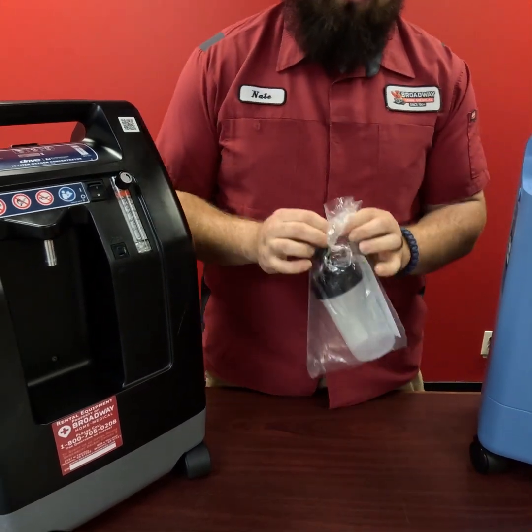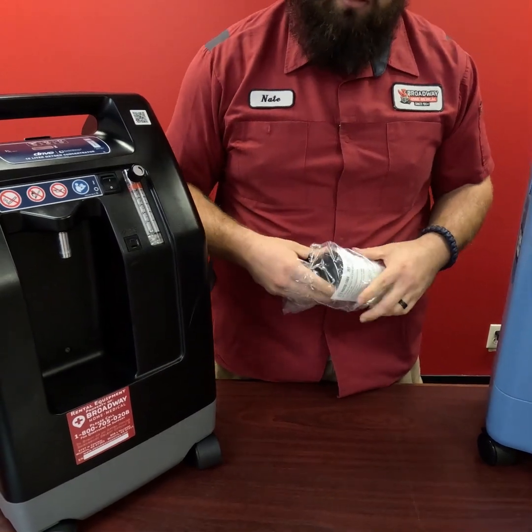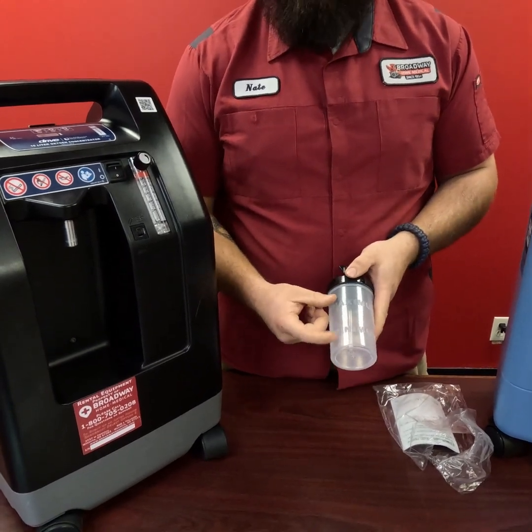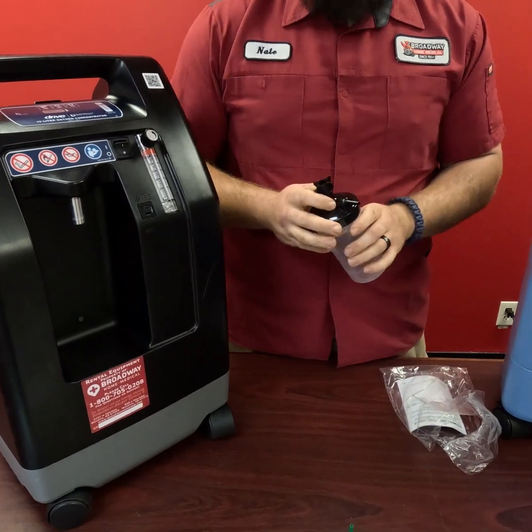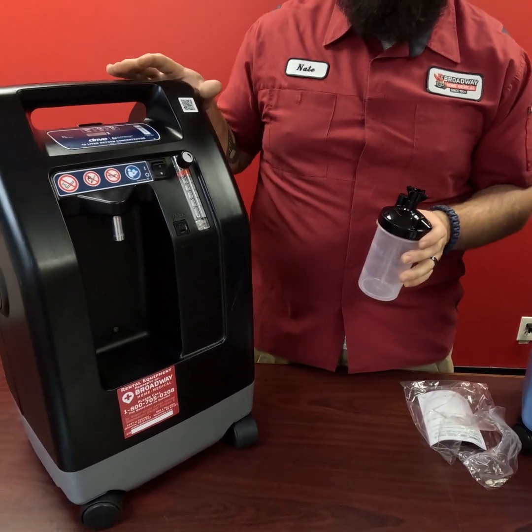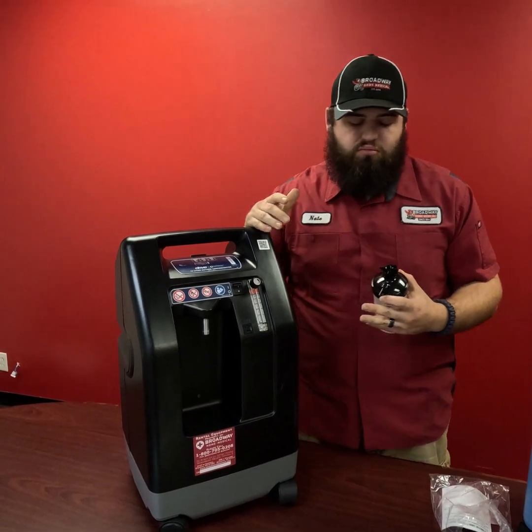Now these humidifier jars should only be used with distilled water only. If you do use any other kind of water, you will get contaminant buildup in the bottom of that over time, and it can clog hoses, and it can cause back pressure on the machines, which in turn also causes problems for these machines.